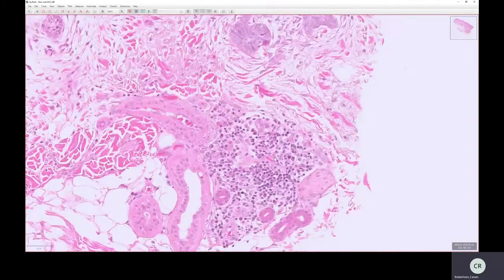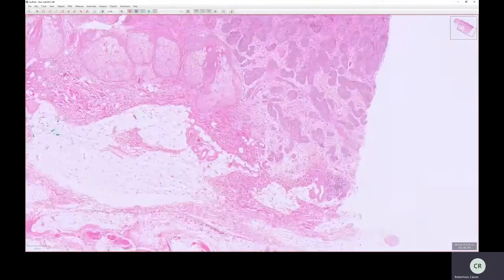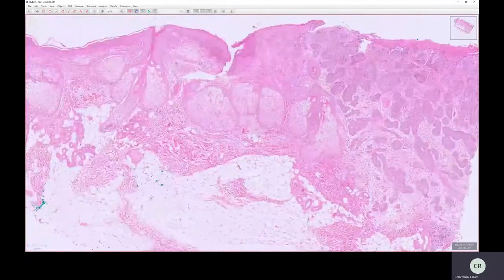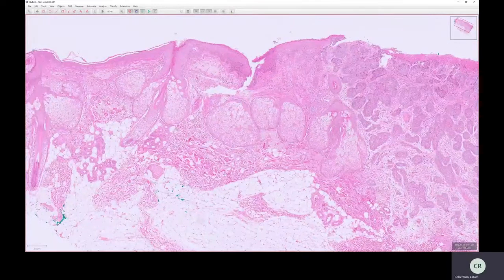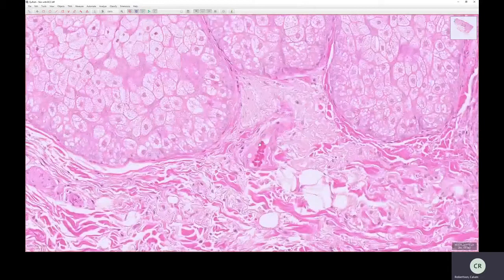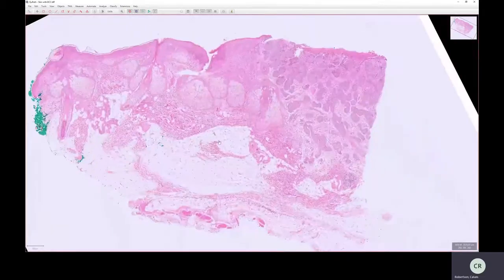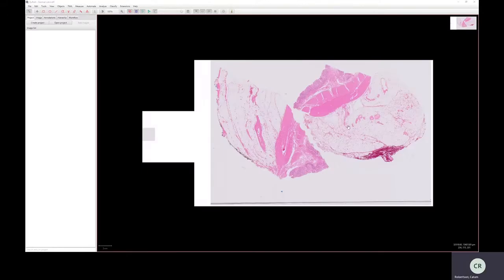We didn't really come across good examples of acute inflammatory cells or neutrophils in this section, which is a bit unfortunate, but I'll go and find a GI biopsy for you so we can look at that in a second. And we've got our blood vessels with our erythrocytes in them, and I think we've pretty much covered everything in this slide, and that really covers the main tissue types: the epithelium, the blood, muscle, neural tissue, and connective tissue.